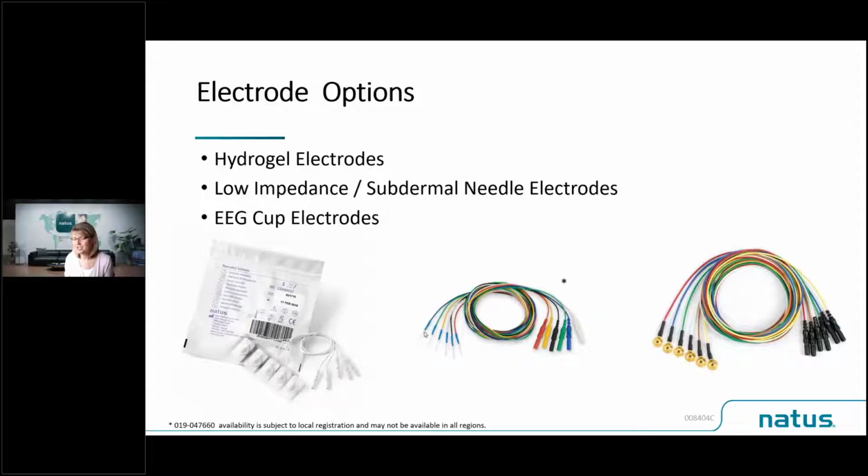People often ask the question, how long would you leave the needles in situ? And again, the answer would be, do consult with your local infection control policies and guidelines. But in general, people will leave functioning needles in place as long as you would leave an IV cannula in place, which generally might range between 3 and 7 days, dependent on what your local protocol is.